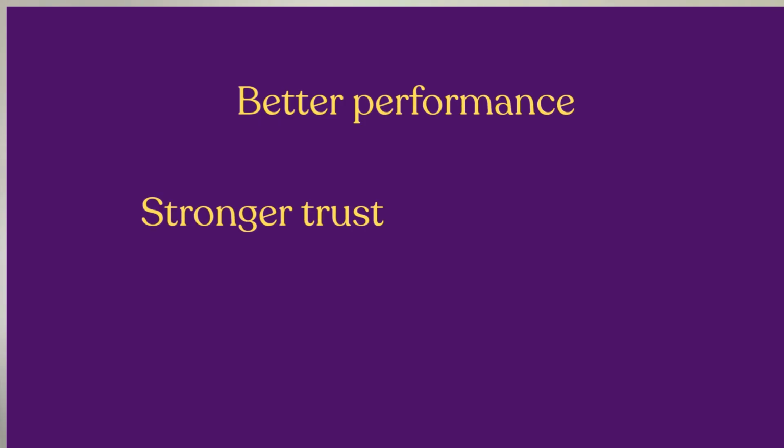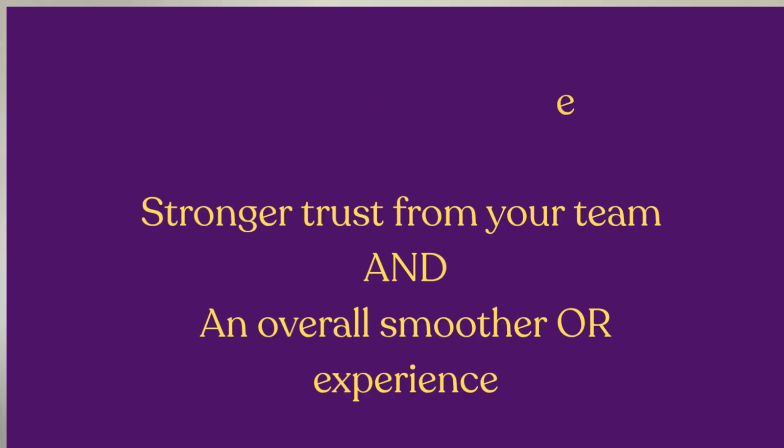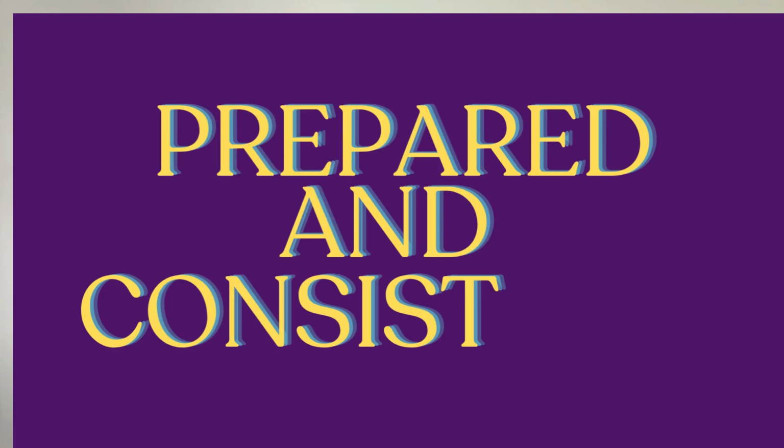By consistently setting up your workstation early, verifying the correct patient information, and handling any system alerts correctly, you'll start to feel more confident and in control in high-pressure situations. Over time, this leads to better performance, stronger trust from your team, and an overall smoother OR experience. You don't need to be perfect, you just need to be prepared and consistent. That's what builds real confidence.